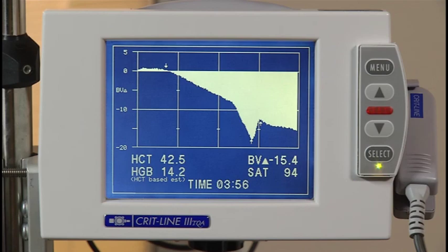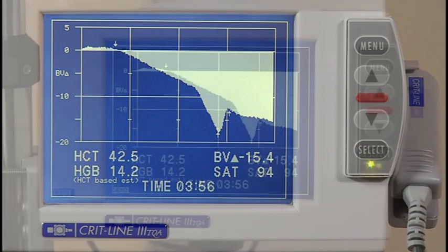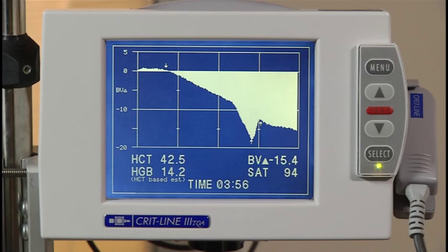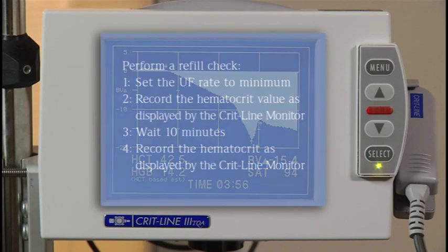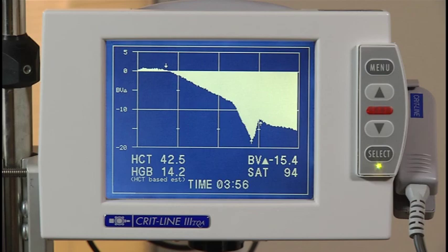Anytime the ultrafiltration rate is minimized, you can check to see if refill is present. In this profile, the UF is set to minimum where you see the second arrow at approximately two hours and 45 minutes. During the next several minutes, you see the blood volume profile has increased significantly, meaning the patient is continuing to refill into the vascular space and has more fluid to remove. A refill check can be performed by following these steps: set the UF rate to minimum; record the hematocrit value as displayed by the CRITLINE monitor; wait 10 minutes and record the hematocrit again. If the hematocrit has decreased by 0.5 during the 10 minutes, then the patient is considered to have vascular refill.